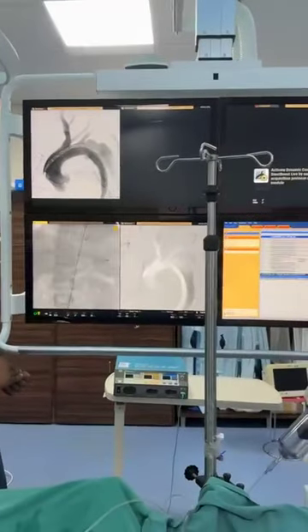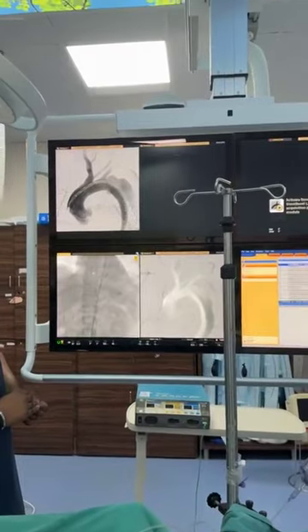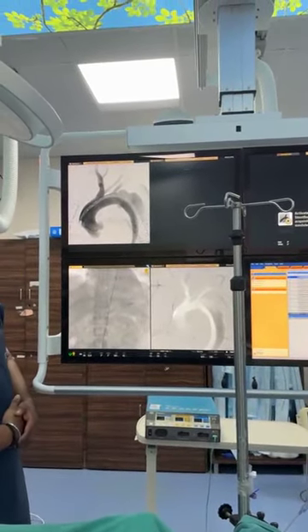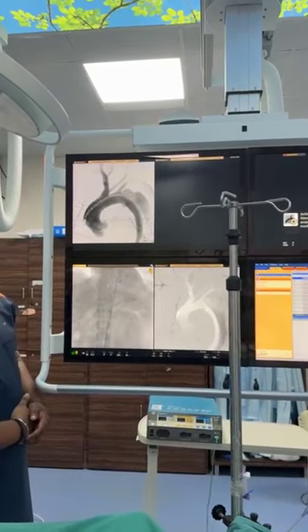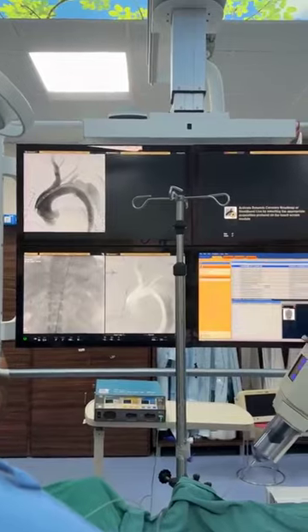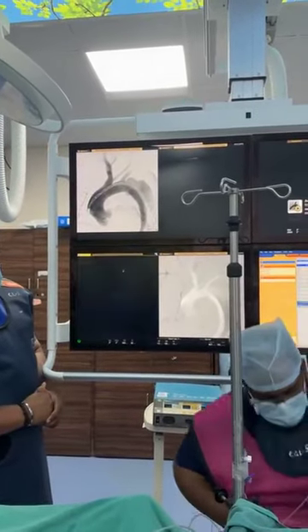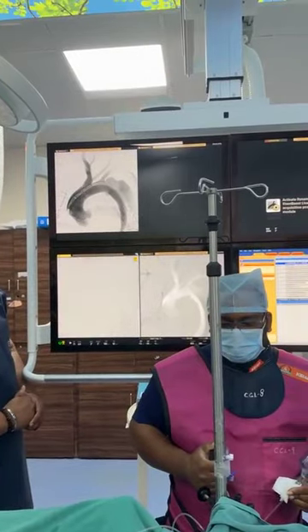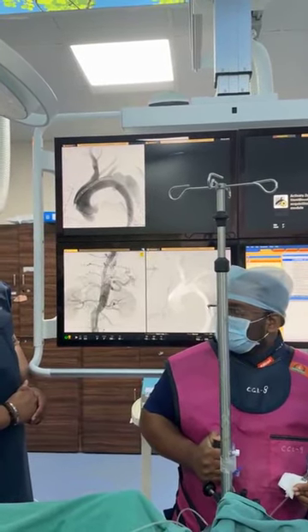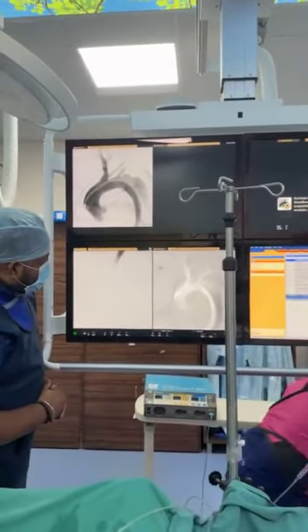Dr. Prashant, we will request you for full DMAT, beta. One echo. Bas. All right. Table. All right. Apnea, please, Dr. Prashant. Inject. All right. Oh, beautiful, great. Chalo. Everything from true lumen, everything. Fantastic job.